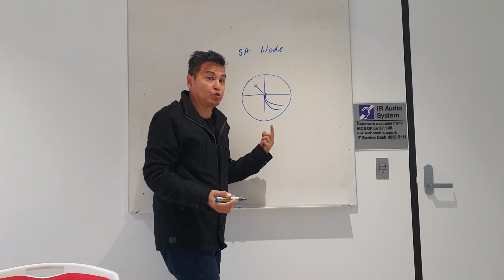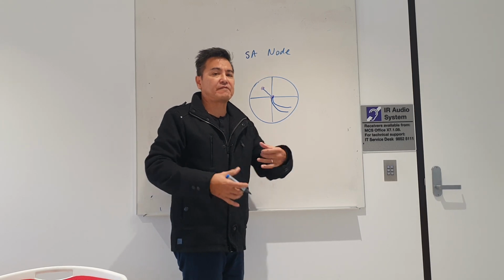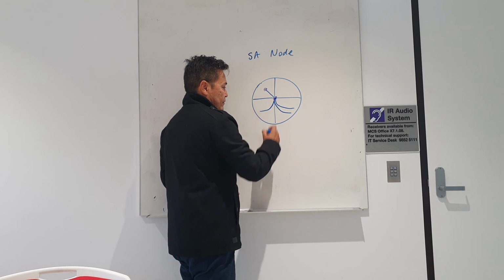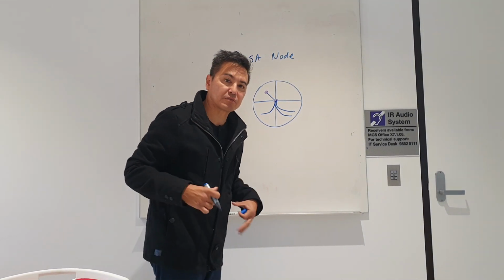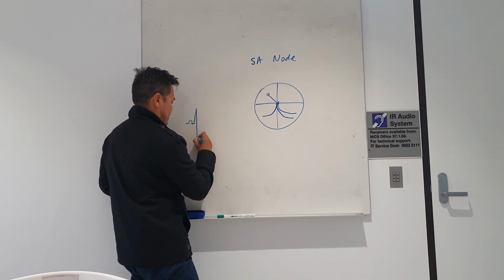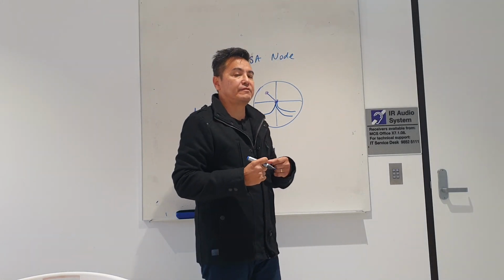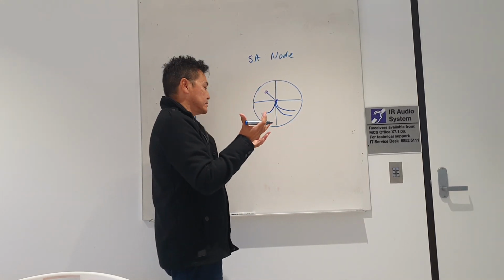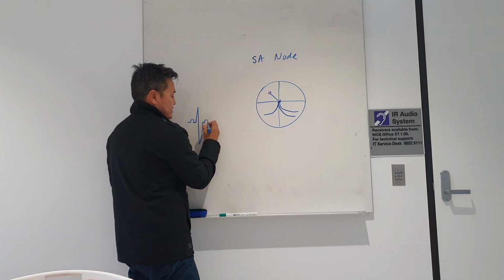I'm going to draw 2 sort of vectors or currents that go down the left ventricle, because the left ventricle is huge. If I was to draw it to scale, it would be so much larger. And then one goes down the right. And if I capture that electrical event too with those 3 leads, it would look like this. And then the electricity kind of finishes, okay? And when it finishes, everything just resets, and when it resets, it also looks like this.